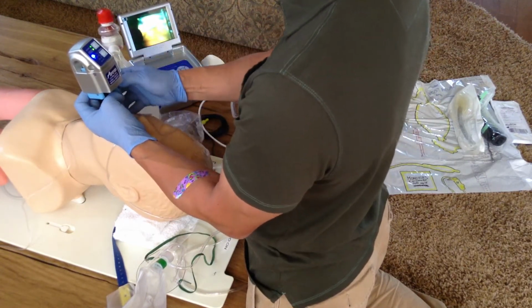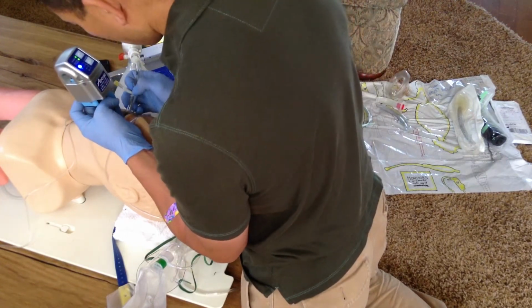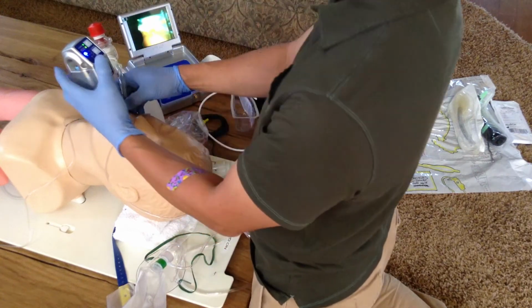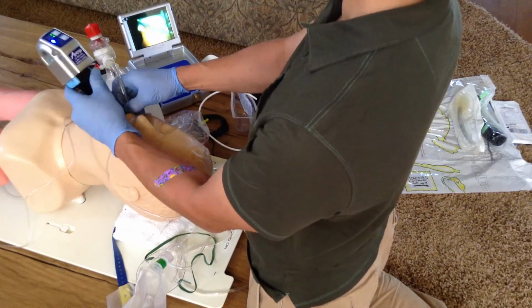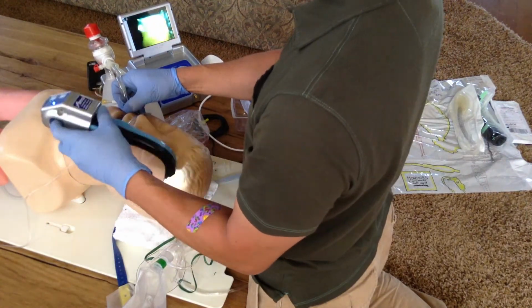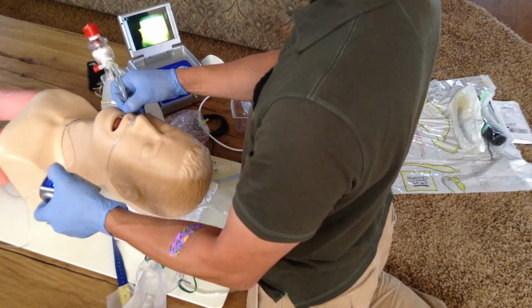Break this open and see that I'm at a good depth. I'm 22, 21 at the teeth there, and then slowly slip this out, making sure I'm not pulling the tube out, extubating the patient at the same time there. Turn my light off, turn the power off.